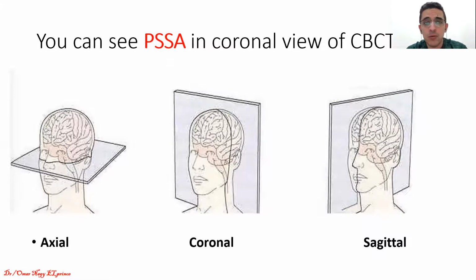Okay. It has another implications to know ان في حاجه اسمها posterior superior alveolar artery، لان انت لو عملت له injury it will affect some potentials of the Schneiderian membrane itself او الغشاء المحيط بالماكسيلاري ساينس. بس يعني هو ده not our topic for today.